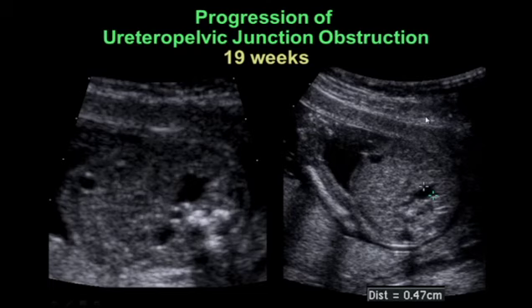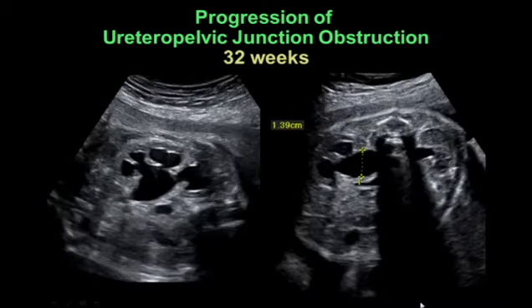Here's a fetus who at 19 weeks gestation had a very mildly dilated renal pelvis at 4.7 millimeters. For us, this would be classified as possible hydronephrosis. But by 32 weeks gestation, we can see this had progressed to a large ureteropelvic junction obstruction. We see the renal pelvis now measures 14 millimeters, and we see calyceal dilatation inside the kidney.